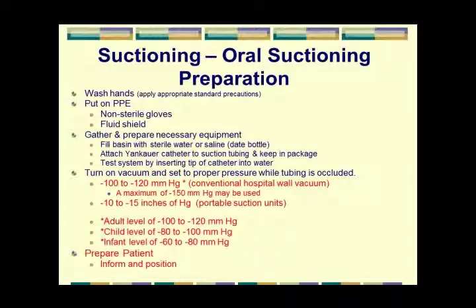Wash hands, put on non-sterile gloves, because it doesn't have to be a sterile procedure. We're going to have some mechanism to fill a basin with sterile water or saline. And whenever you open a sterile bottle of saline or sterile water, you want to date the bottle so that we know how long it's been there and dispose of it appropriately. Attach my Yankauer suction. Verify that it's functioning by putting it into that water source. That's how you tell if the system has a leak in it or not.